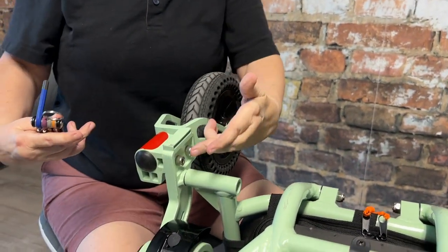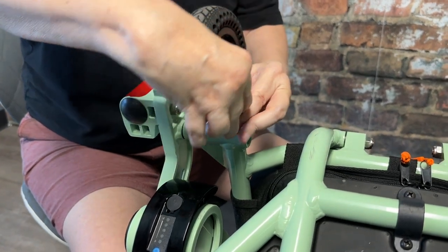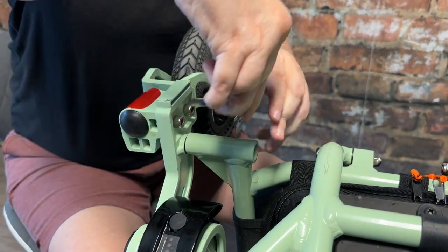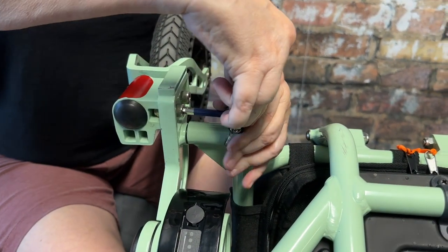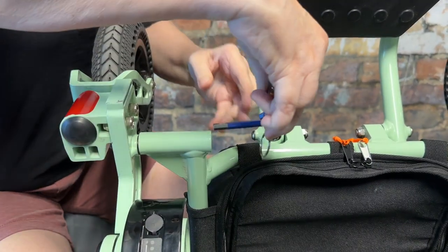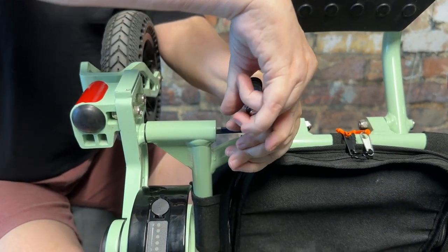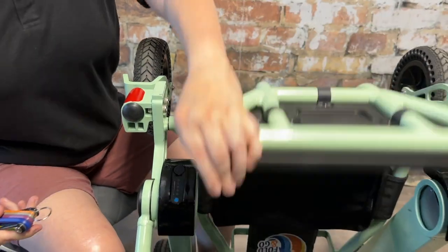Next we're going to switch to the blue hex head and tighten the three bolts on the left side of the chair. Left and right are always from the user's perspective — the person sitting in the chair. Once you tighten these three bolts, make sure they're tight and we can move on to the next section of the chair.